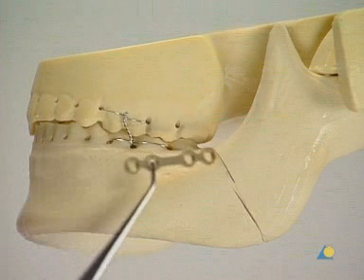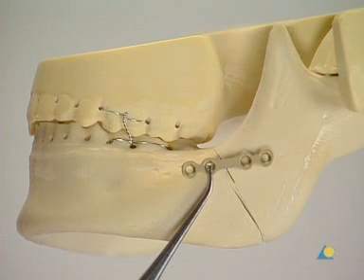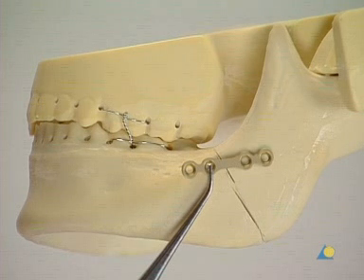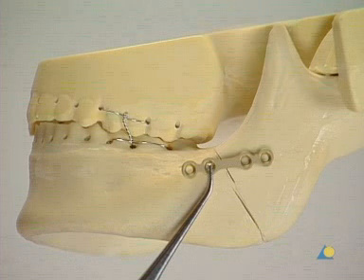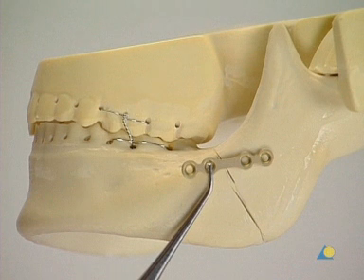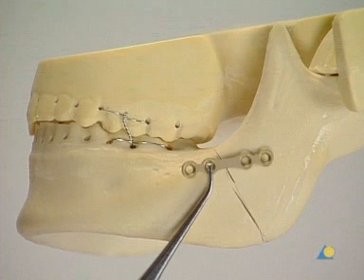A 2.0 mandible mini plate with center space is placed near the upper border of the mandible. When choosing the plate, it must be considered that at least two screws are needed for each main fragment and that sufficient distance be maintained between the fracture line and the closest screw hole.